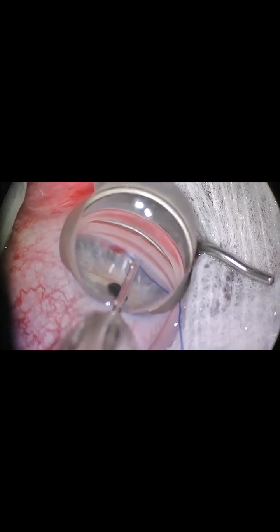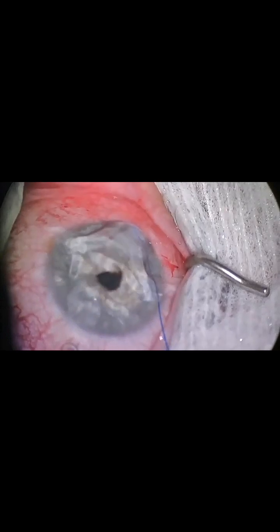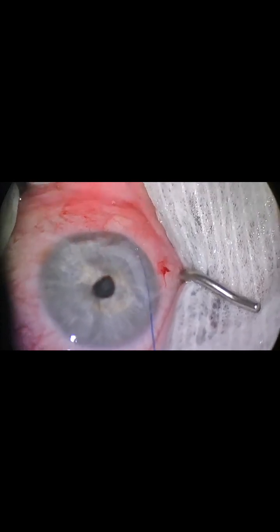To assure that the suture is exactly in Schlemm's canal, we need to take a look with the gonio lens, because if there's any PAS, there's a chance that we may induce iridodialysis. As you can see in the mirrors, the suture is in Schlemm's canal and there's no PAS.